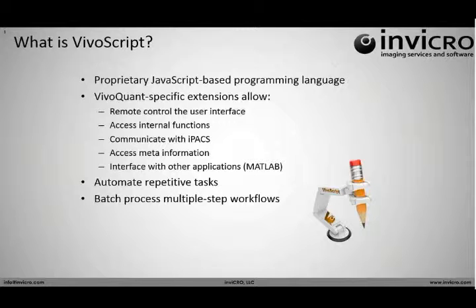A lot of people have mentioned it, so you've been hearing about it, but it's a JavaScript-based programming language. Just like JavaScript allows you to access elements from an HTML page on the internet and run operations and do certain computations behind the scenes, VivoScript allows you to do the same thing with VivoQuant.